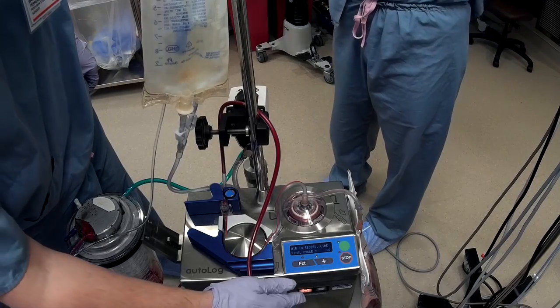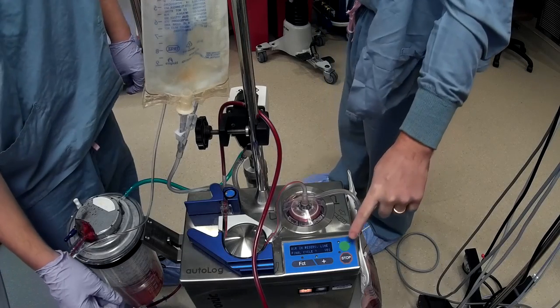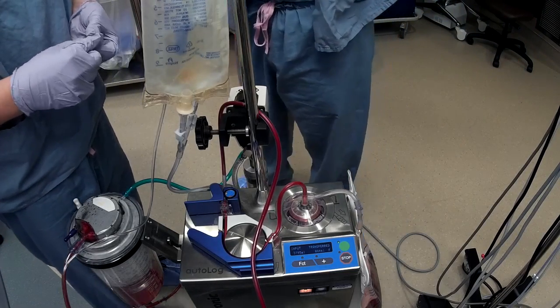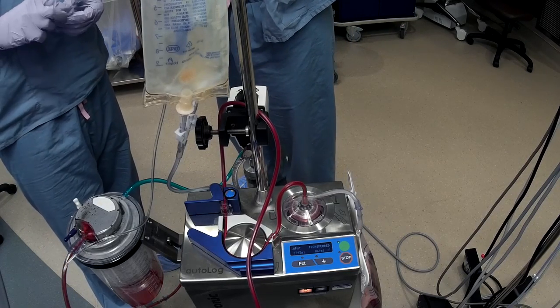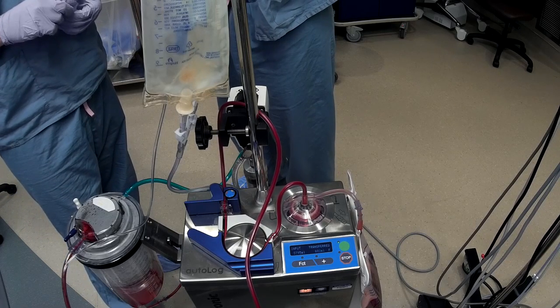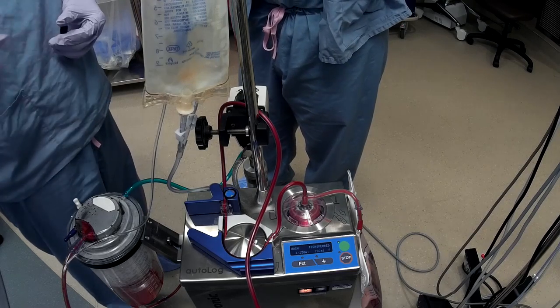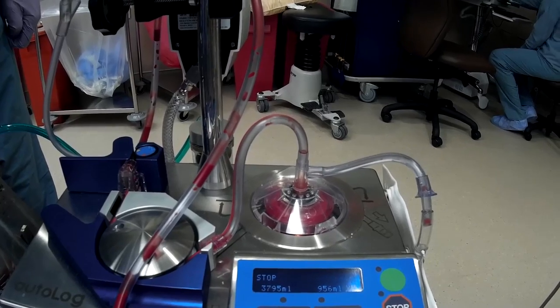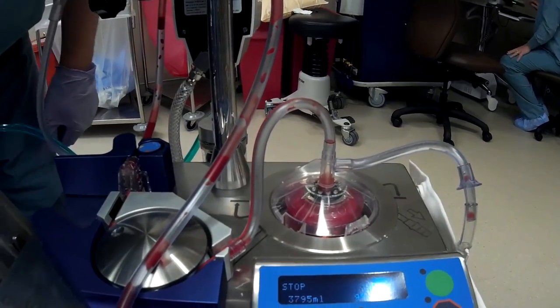If at any time there are not enough red blood cells to process a complete bowl, the machine will ask you if you wish to run your final cycle. If it is the end of the case and you wish to do so, hit the plus button to change the answer to yes and hit the green button to start. Since a full bowl of red blood cells is required to displace excess effluent, the machine will draw additional red blood cells from your collection bag to make up the difference. Once the final wash is completed, the cell saver will display your final process volume and your final red blood cell volume.